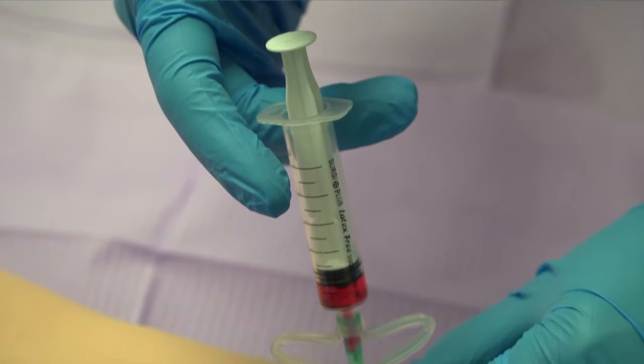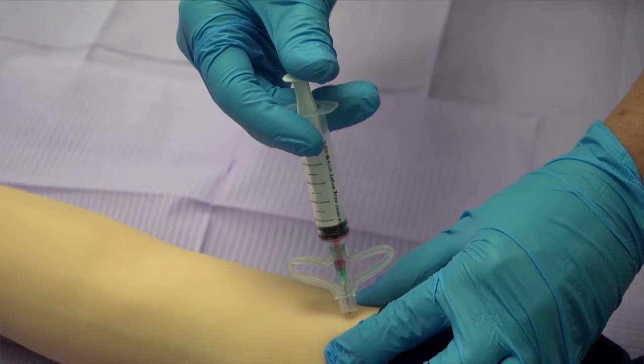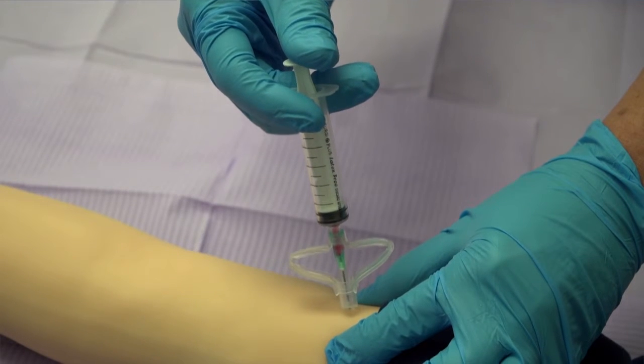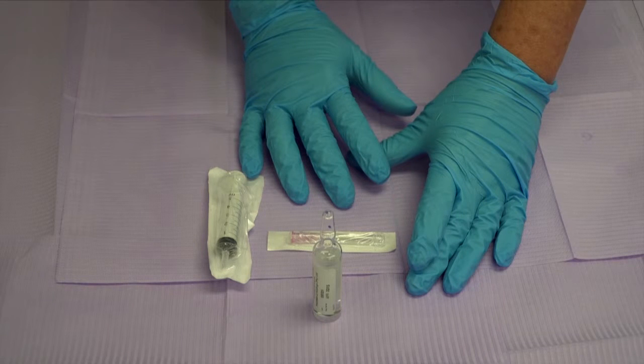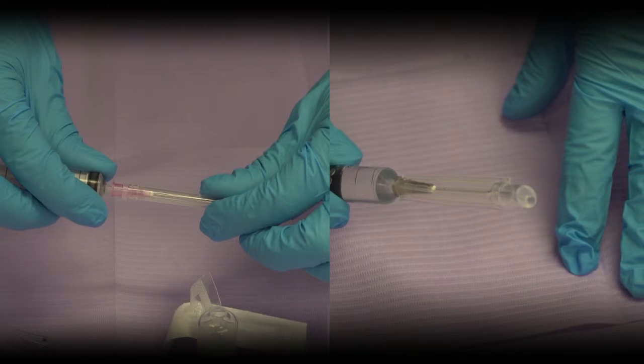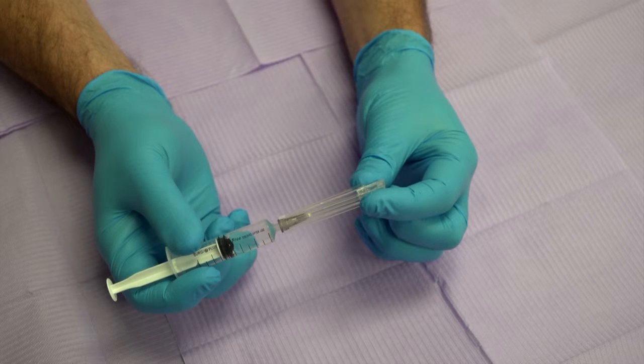Important information when performing an intramuscular injection using a Reflex Safe Safety Needle. Note, it is assumed that the clinician is acquainted with the clinical procedure and is following standard operating procedures. When withdrawing drugs from vials or glass ampoules for an IM injection, a two-needle protocol is recommended. The first needle, preferably a large-bore blunt fill needle, is used to withdraw the medication from the vial. The second needle, used to perform the IM injection, should be a Reflex Safe Safety Needle to protect the clinician from a needle stick injury.